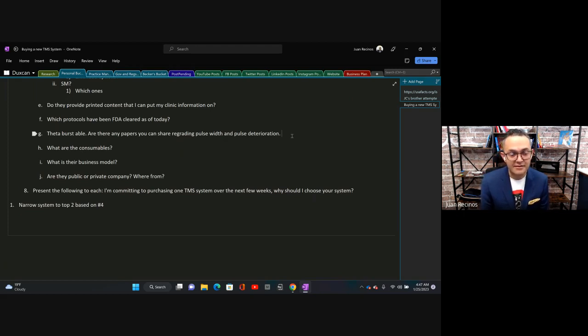And from what I hear from my friends out there, because I have many friends in healthcare and in psychiatry, half of the clients like it, half of the clients don't. Because you lose the human piece, the human interaction aspect of it, there's a whole other 10 hours we can dive into. You lose that human touch if you do it too quickly, and oftentimes that helps with calming the patients down and an overall better experience. But the other half love it because they're working professionals and they don't earmark time to take care of themselves as much as any of us should.